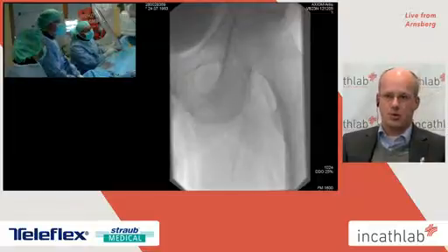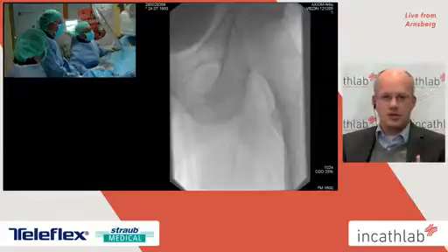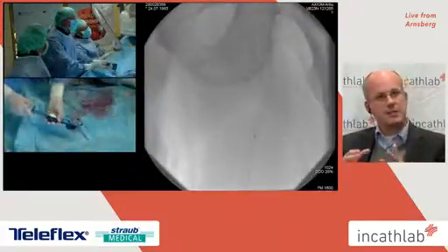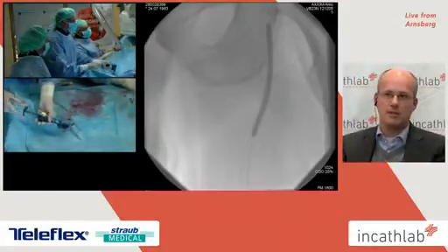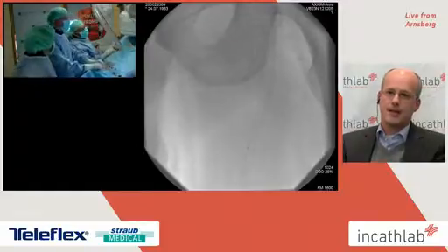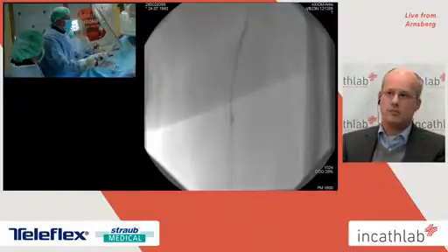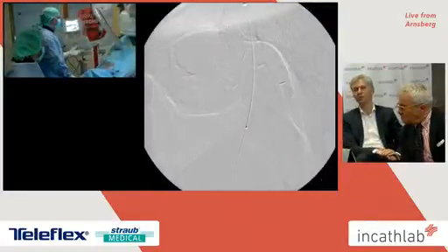If there's a problem of clogging of the catheter, too much thrombus amount, then the machine gives you feedback, and this is the moment we take out the catheter, clean it, and bring it back into the patient. It depends definitely on the thrombus amount and on the organization of the thrombus, and I would recommend to clean it in every second run. And to clean it means just to bring it out, put it into a water bed and then activate it.